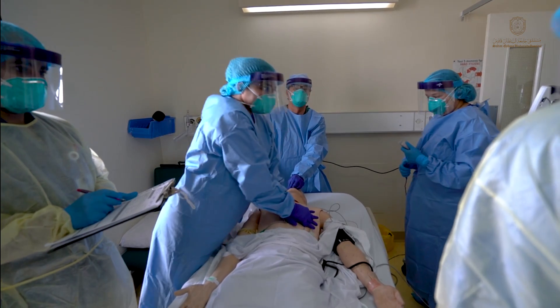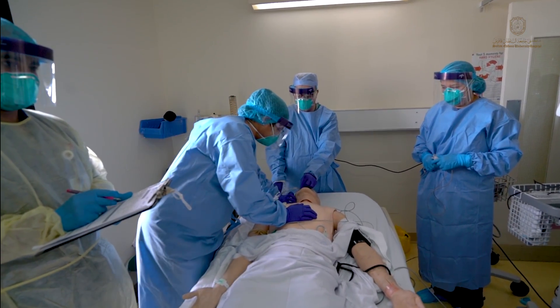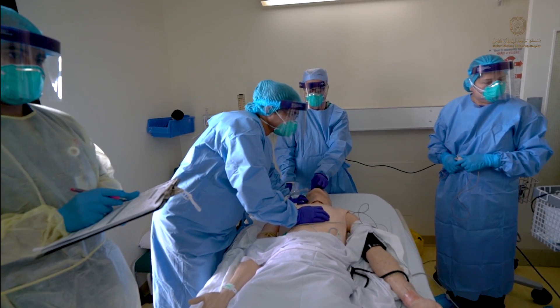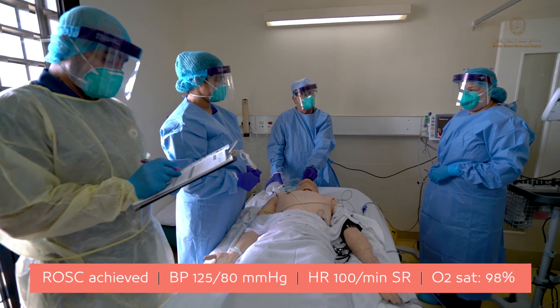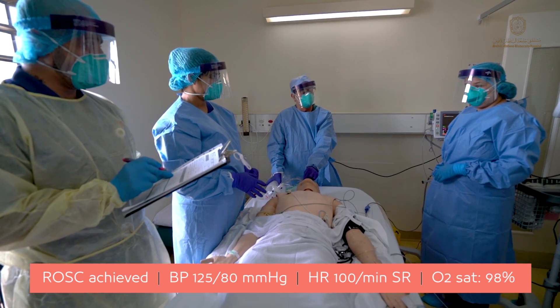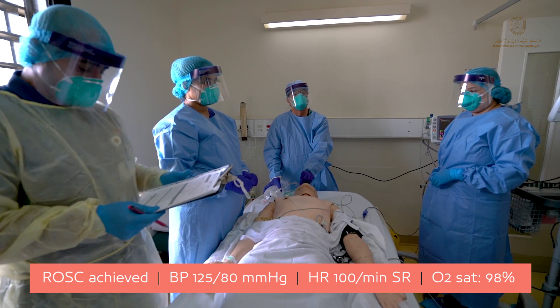Two minutes are over. Can we check for return of spontaneous circulation? Can we check the pulse? ROSC achieved. Can we check the vitals? The vital signs are blood pressure 125 over 80, pulse rate 100, and oxygen saturation 98%. On achieving ROSC, apart from the usual post-ROSC care, alert the ICU that a suspected or confirmed COVID case is coming so they can prepare for the required care.